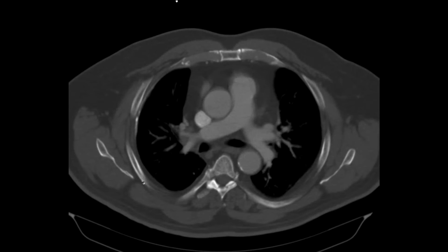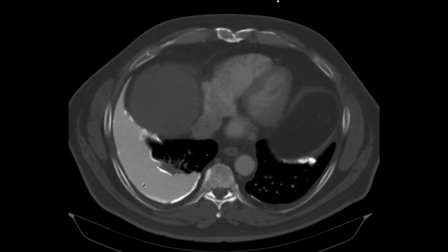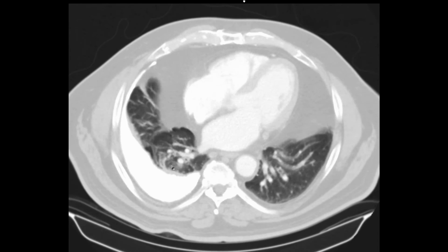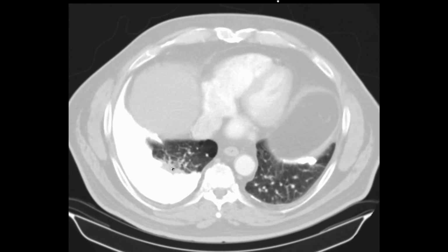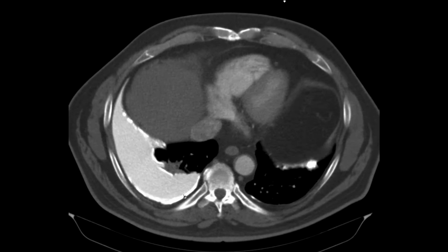elsewhere. It's quite extensive here, but is there atelectasis in that left lung base associated with this pleural calcification, or is it the lung? It's a little atelectatic near it, isn't it? I presume, I don't really know what's in that little patch of parenchyma on the right side. But David, would you agree those are pleural asbestos plaques on the left hemidiaphragm and posterior there on that image? I would vote they were too.